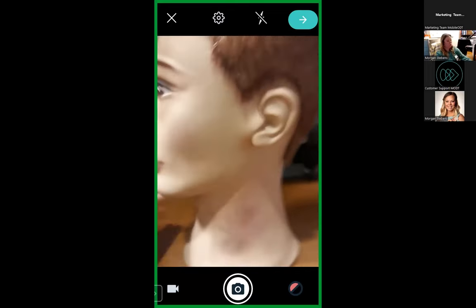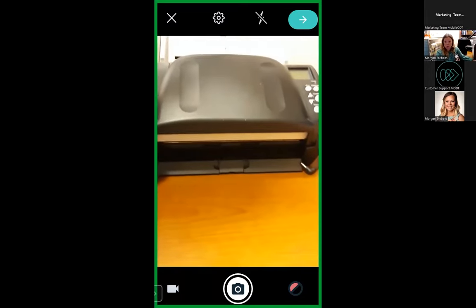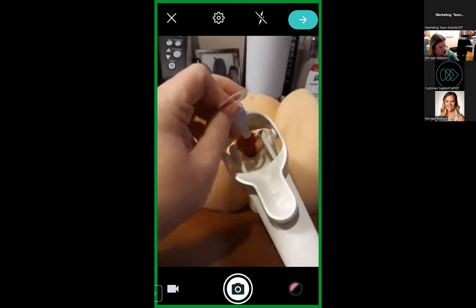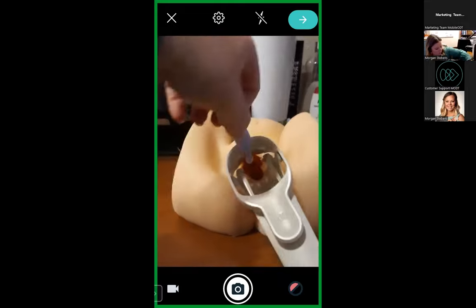Okay, so now we're going to go to utilizing the colposcope in a pelvic exam situation. So I have a pelvis here that I'm gonna utilize. Let me pull this tab so that I can, oh, I just pulled it off, hang on. Sit that down for a second. Okay, now I have a light in there so you can see what's going on.